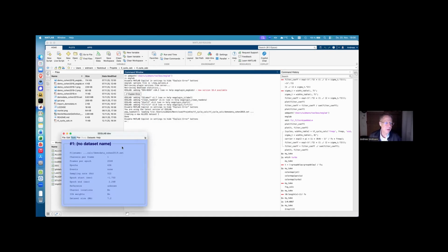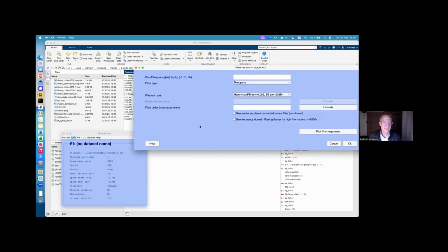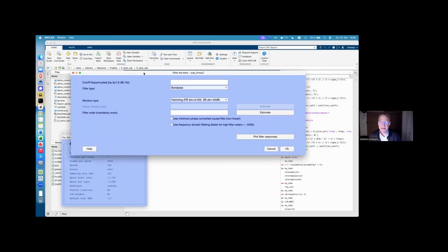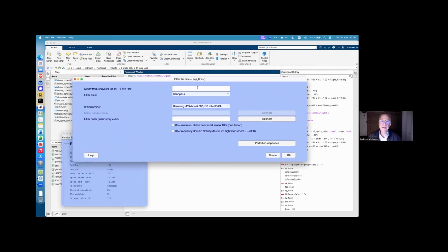I would recommend, if you use EEGLAB, to use the windowed sinc filter. The math behind it is exactly the same. Also, the default filter is based on windowed sinc. The math is identical, but here you have control over each and every one of the parameters.